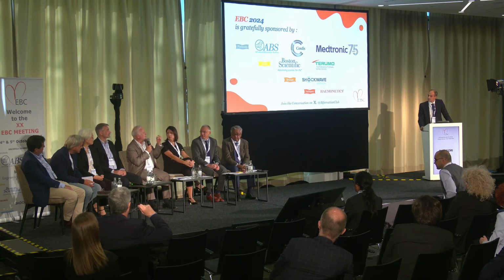This is very close to the modified stenting. What was the name of the Japanese with Antonio Colombo? Kobayashi. Yeah, Kobayashi. It was modified stenting, just before the crush. It looks like the only difference is the dilation, so you have to introduce that in modified stenting.